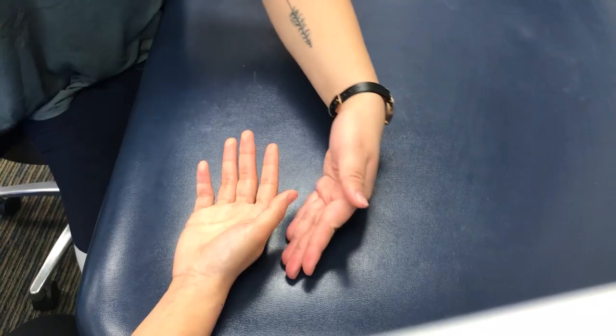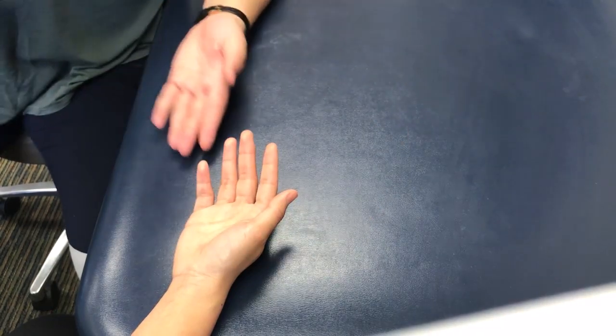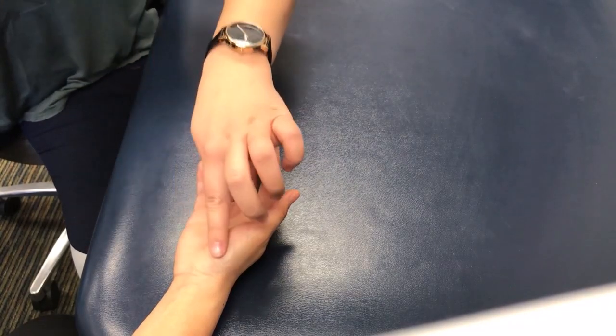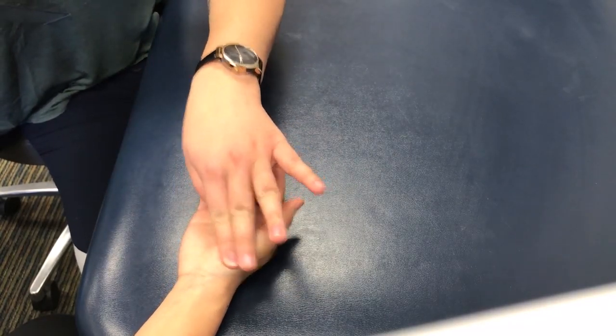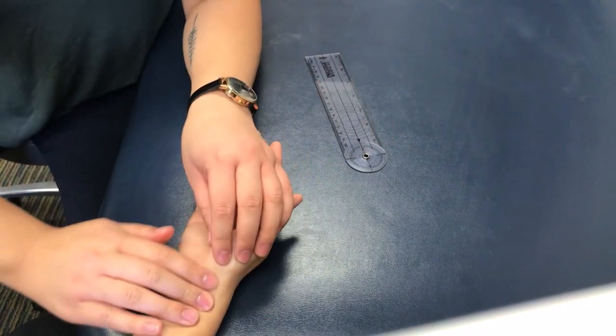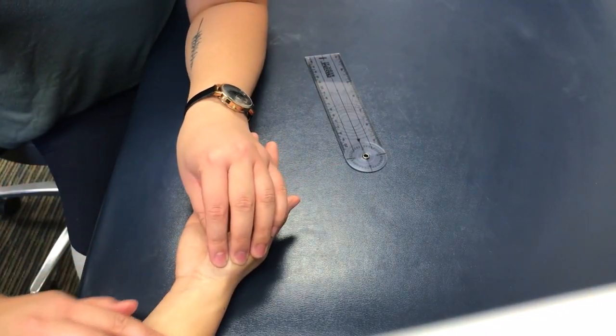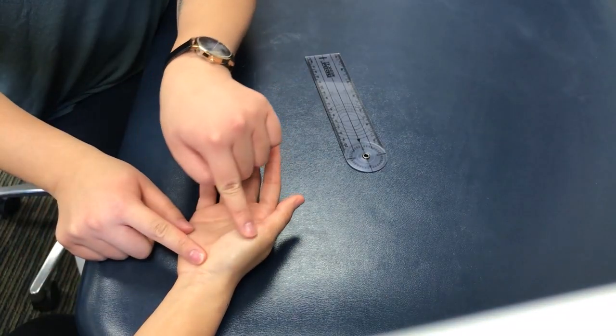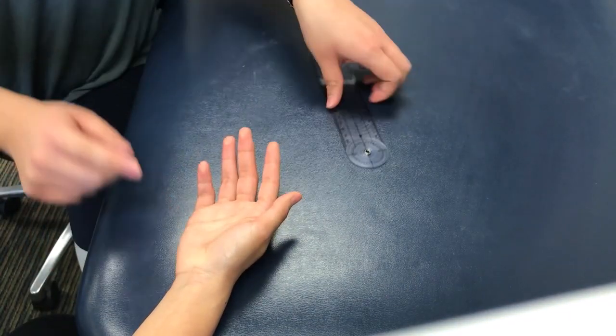For thumb CMC flexion, you'll have the patient sitting in a chair with their arm resting on the mat table as so, and their forearm is supinated, the wrist is in neutral, and the palm is up. So the axis will go on the palmar side of the CMC joint, and then the proximal arm will be along the midline of the radius, so palpating for that, and then the distal arm is going to be along the first metacarpal.